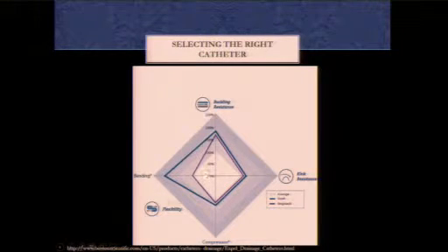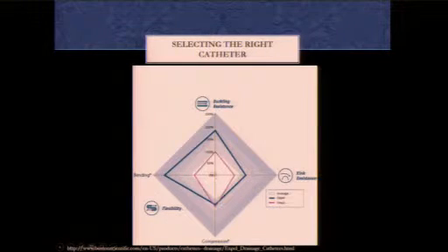So you can see here, the dark blue line is the Boston Scientific drain. So obviously, they're trying to show that it's better than the rest of its competitors. They use 3 catheters in each case, so they have a small sample size. But basically, they're trying to say that there's not a huge variation in the physical characteristics of the drains.